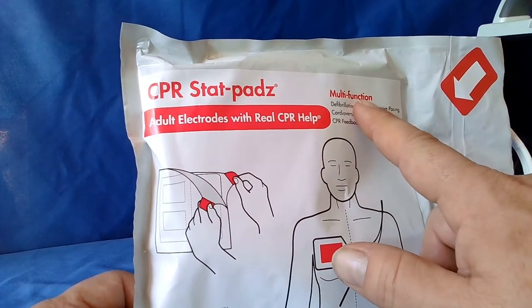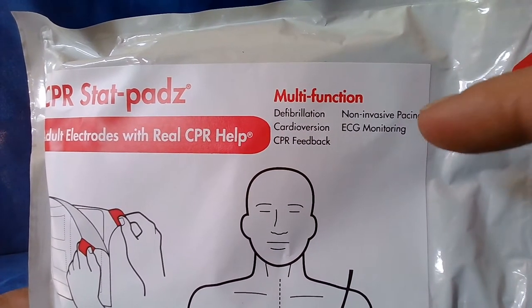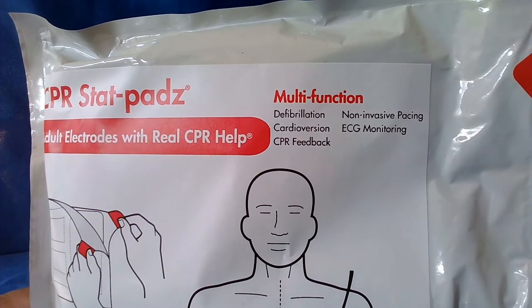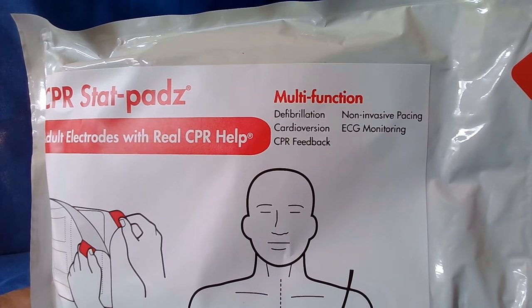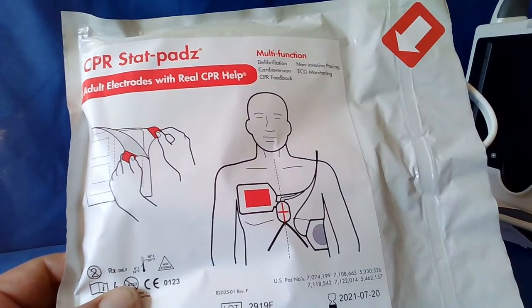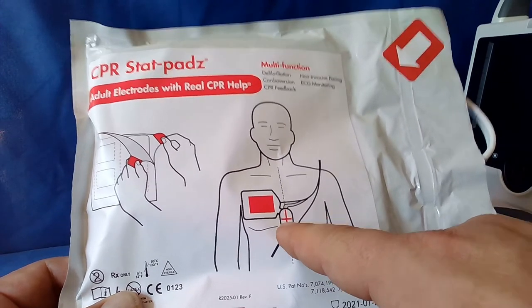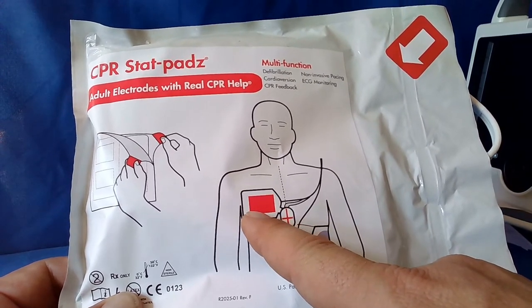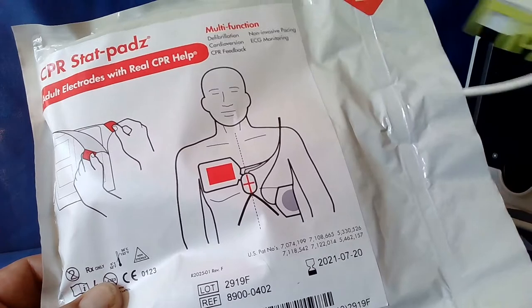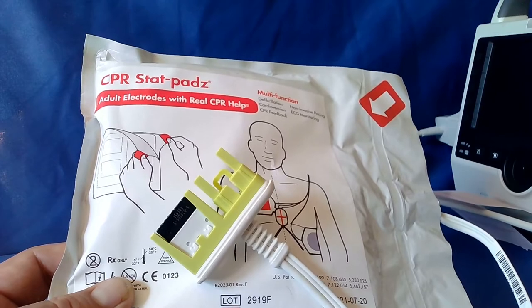And these are a multifunction pad. With these pads, you can do defibrillation, cardioversion, non-invasive pacing, ECG monitoring, as well as CPR feedback. As you can see with Zoll, there's a lot of pictures that help guide you along. Inside your pack, you've got a set of pads with an accelerometer, a sternum pad, and an apex pad. You also have a cable that you would now plug into your multifunction cable on your device.